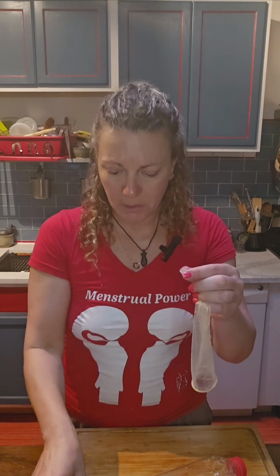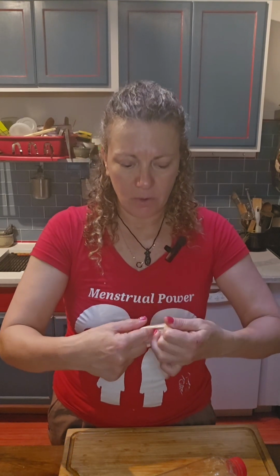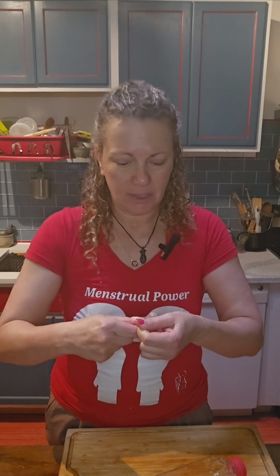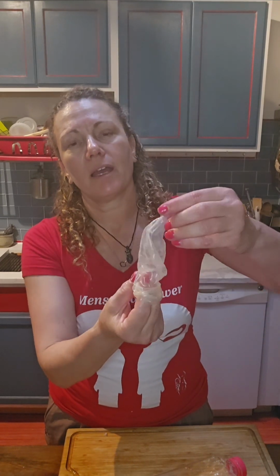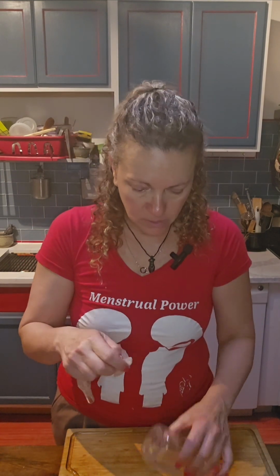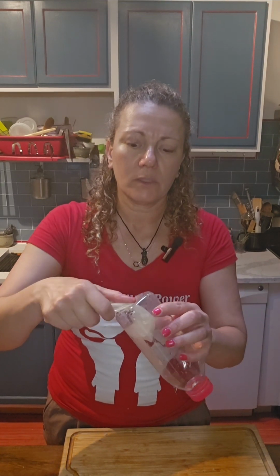I'm making a very small hole at the edge, and the reason is I want this to fit on our tube very tightly, like this. Okay, so you see the condom is on the tube, and we insert it via the hole that we just made.